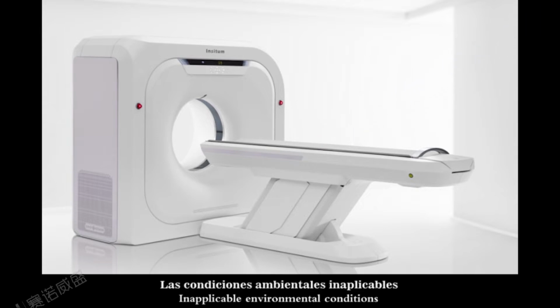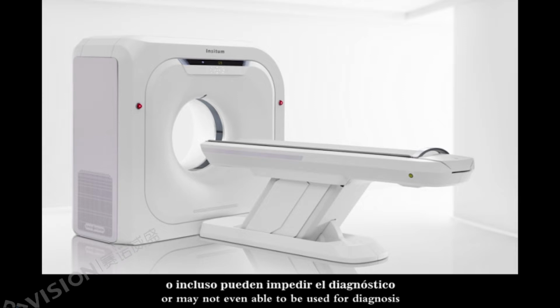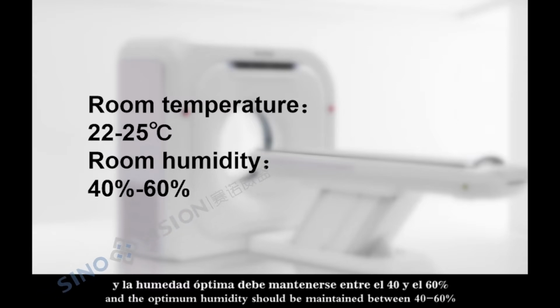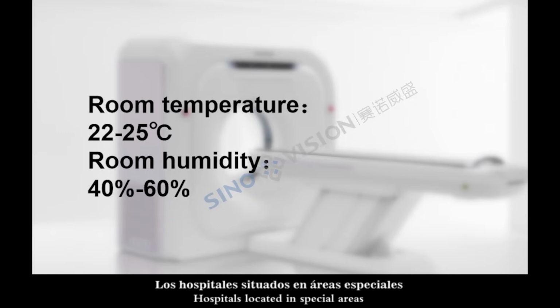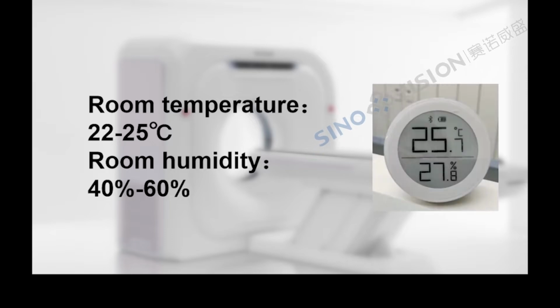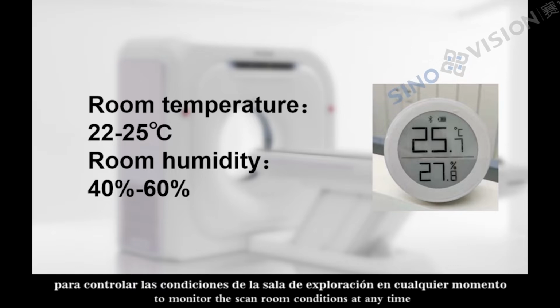Inapplicable environmental conditions may result in a significant decrease in image quality or may not even be usable for diagnosis. The recommended ambient temperature is 22 to 25 degrees, and the optimum humidity should be maintained between 40 to 60%. It is required to install an air conditioner and maintain a constant temperature. Hospitals located in special areas should pay attention to dehumidification and humidification. It is recommended to prepare a hygrometer to monitor the scan room conditions at any time.